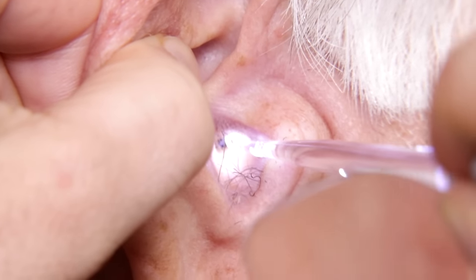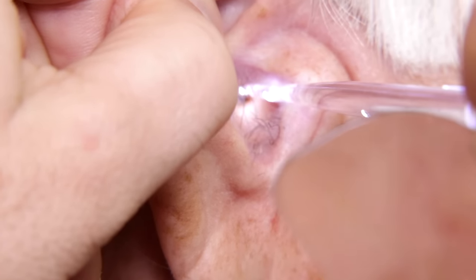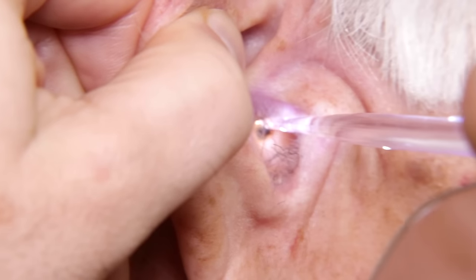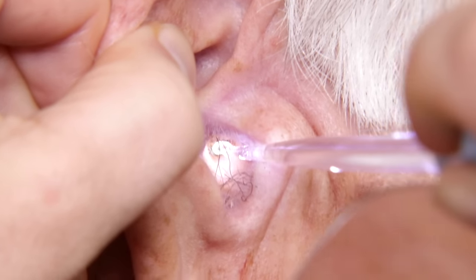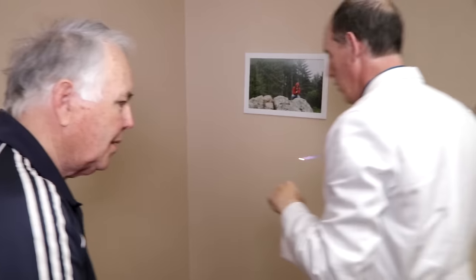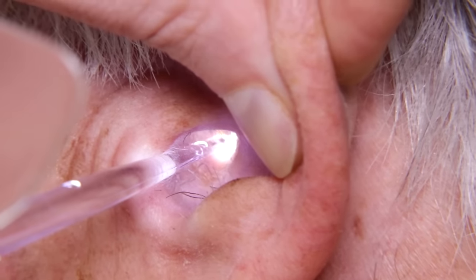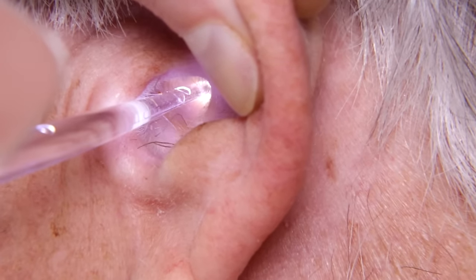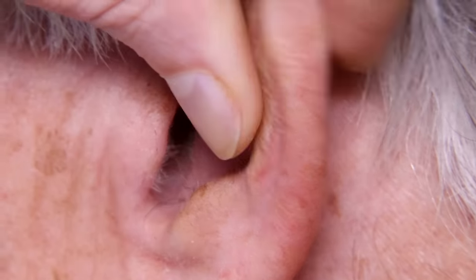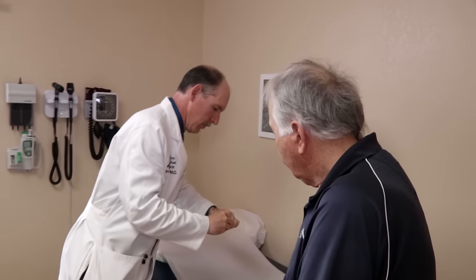Does it hurt to touch in there? No. It's pretty deep, the wax, and it's packed in there. We're not going to be able to make any progress on the right ear with the curette. The problem is I'm using the curette itself to keep the ear canal open, but that limits where I can push it. We're not getting anything with the curette because it's so deep — I just can't get in that deep with it.